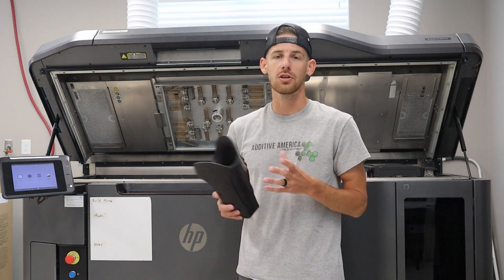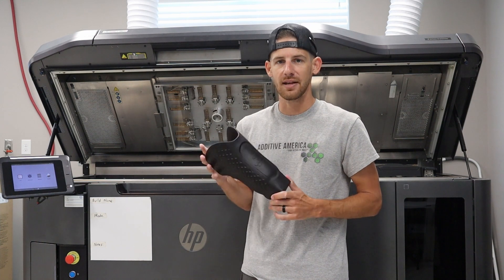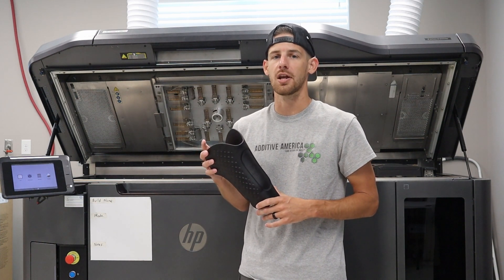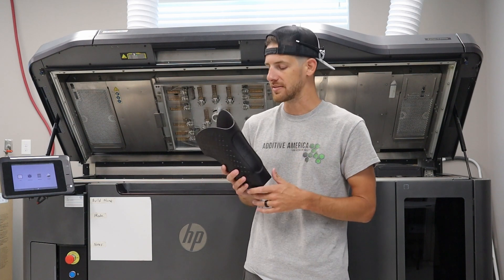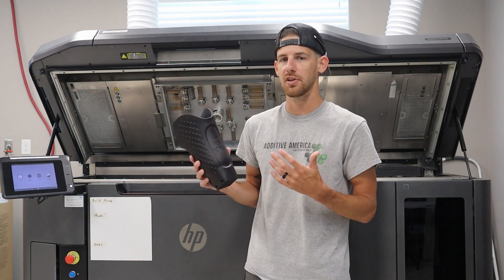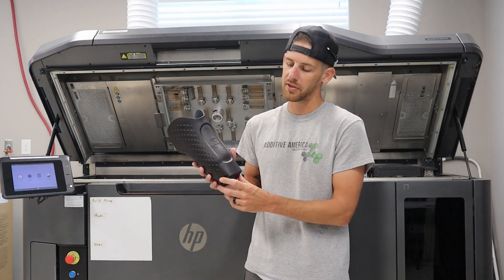A lot of the features done on this could be achieved with traditional manufacturing, but cost and time are prohibiting factors generally when trying to add features like this. I just want to take a quick second here to show you around some of the different features on this prosthesis and give you an idea of what we're working with here at Additive America.